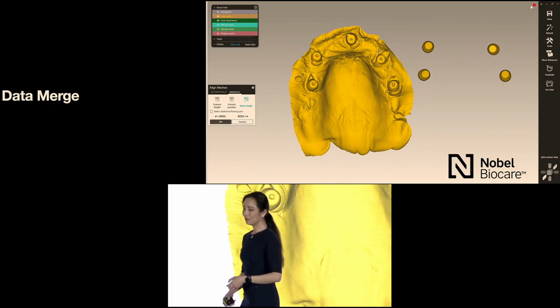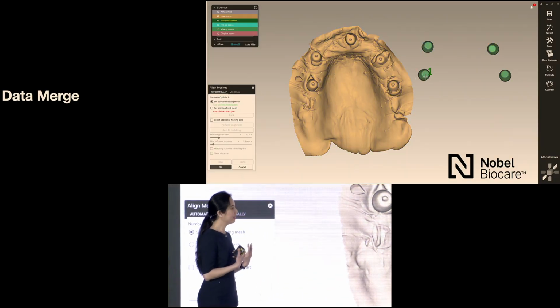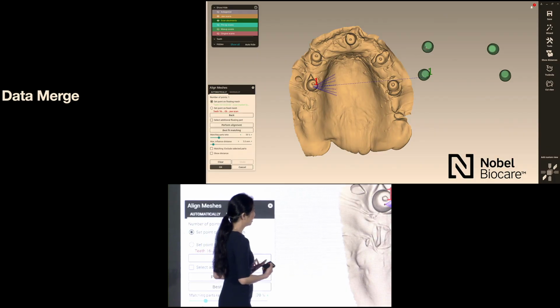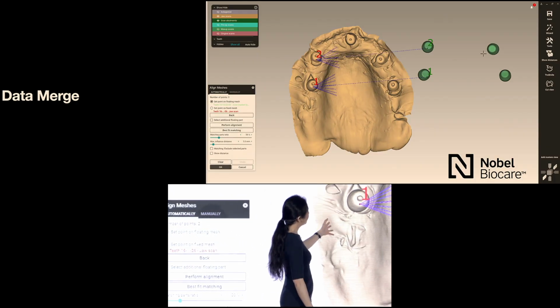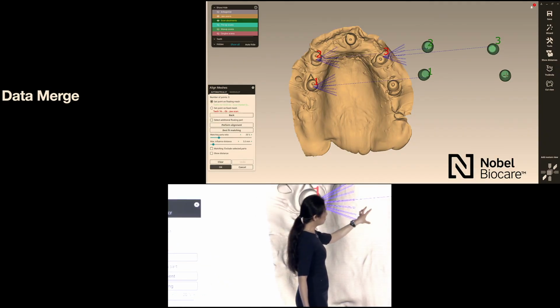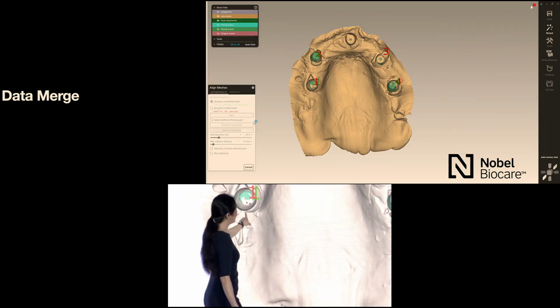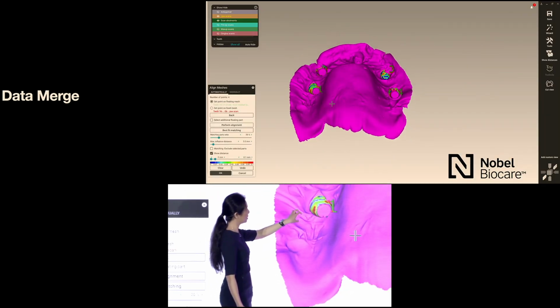And here you'll actually see why having an extraoral scan or photogrammetry gives you a better outcome. So if I were to even scan an impression, what you'll see is that there's a little bit of distortion, but the positioning of the white caps here, because they're made of plastic, have different levels of distortion.